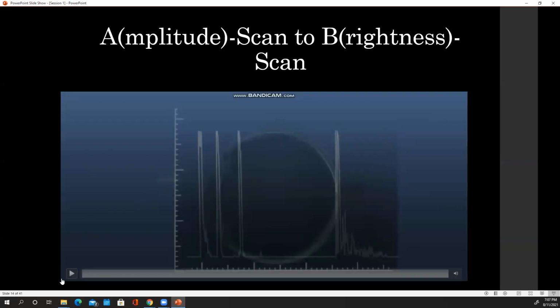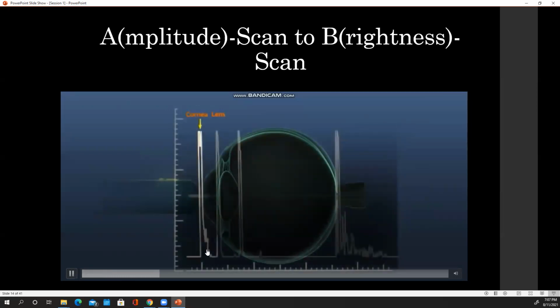the same exact thing that you saw. We're going to say I'm going to have my beam here, and it's going to shoot a laser, well, in this case, an ultrasound. Now it hits the cornea, it reflects, it hits the lens, it reflects, it hits this part of the lens, it reflects, and then it hits that and it reflects the sclera and everything back into the orbital tissues.